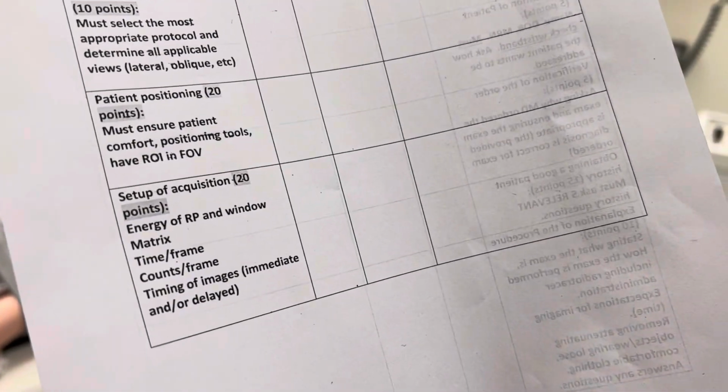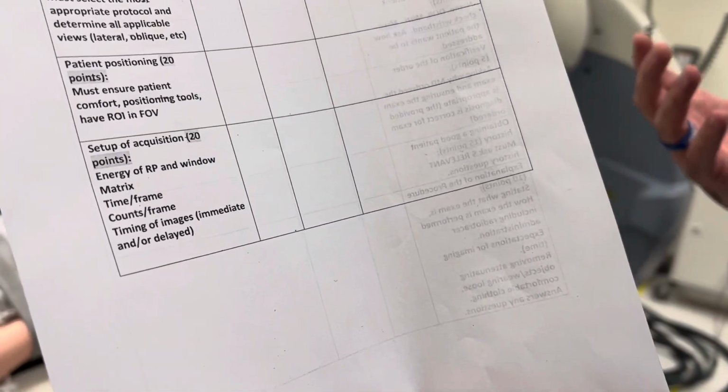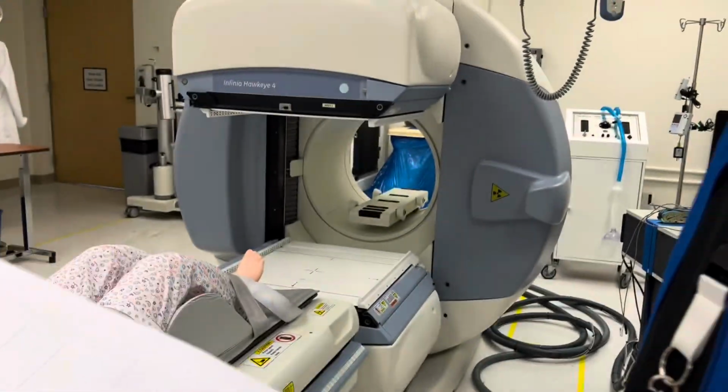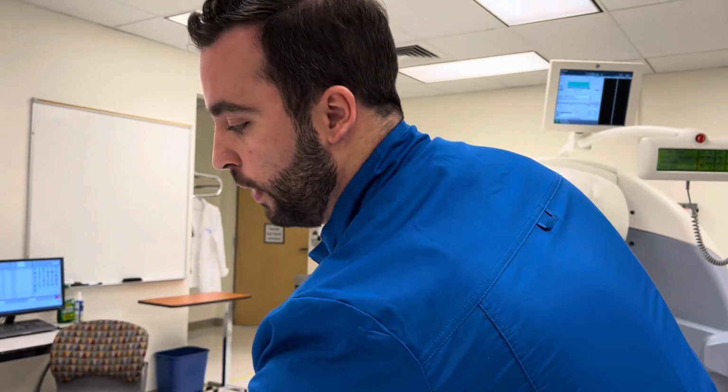For a 3-phase, it's immediate and delayed. For a whole body, it's gonna be delayed as well. So this is the end of the whole body acquisition, and then we will do a 3-phase.